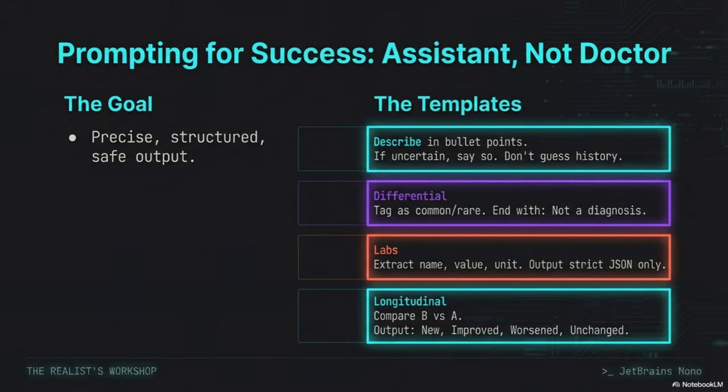And if you do find a quantized build, you have to verify 3 things. Right. Is it the full multimodal instruction-tuned variant? Does the quantization maintain quality for your specific task? And does the runtime actually support visual input? Don't assume that convenience hasn't come with a major fidelity hit.